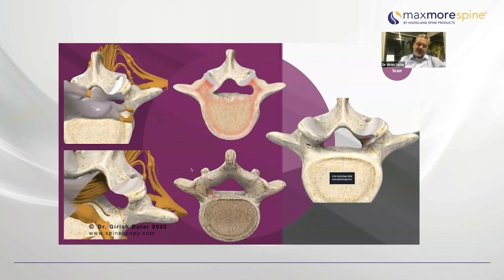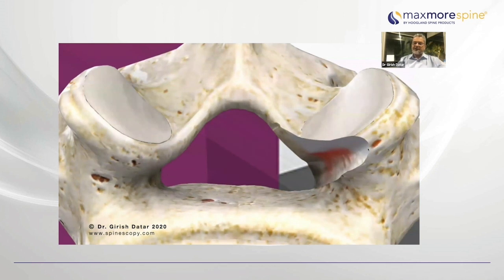So it is coming from lateral to more medial, reaching the paracentral zone. And this is going to be the trajectory. You can see the way the trajectory is going. So the trajectory is going like this, creating more room. So you can cut this, you can cut this, and you can cut this more medially when you reach half of the caudal pedicle. So this is going to be the root here.